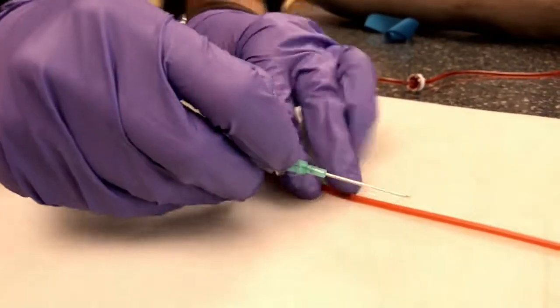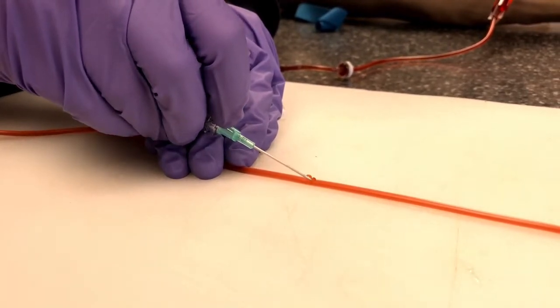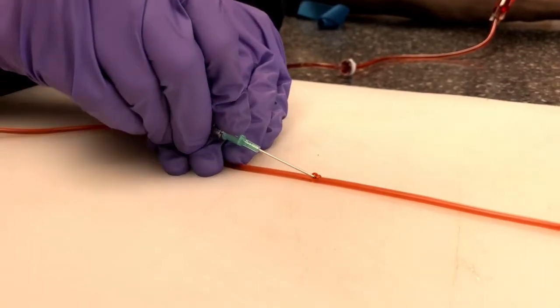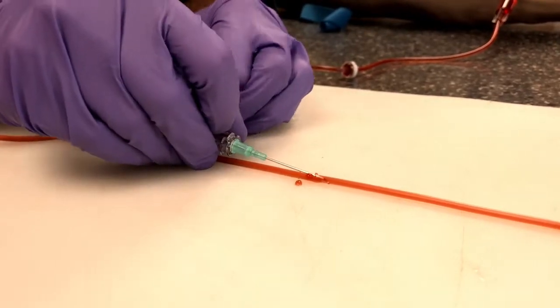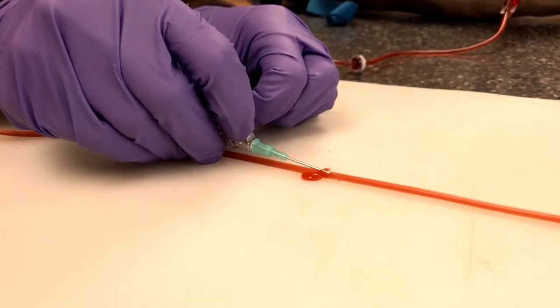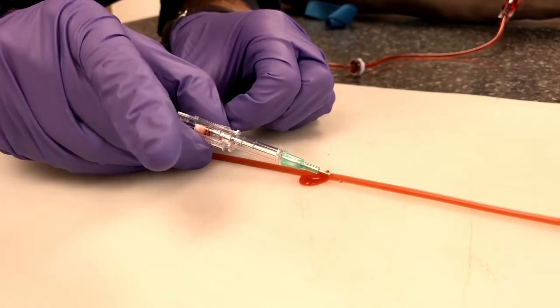We'll see if we can get a good puncture out of the deal, right? So good angle, you go in. Now you see we've got that partial flash, right? Now we just need to go a little bit further and come out the bottom, right? Now you can see where our needle's at because we're using clear IV tubing. Now we can push that catheter forward. You'll notice the needle tip doesn't move, right? And that's what we're looking for. We get a much better flash at that point.